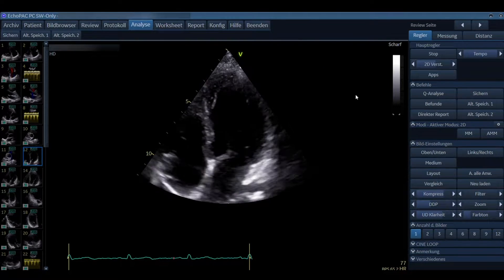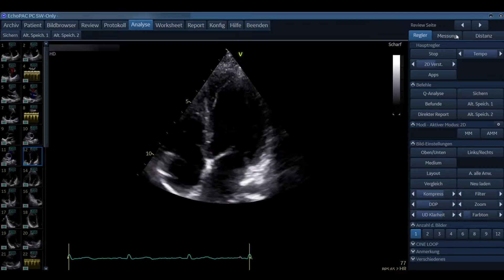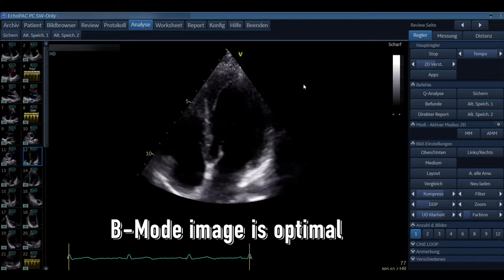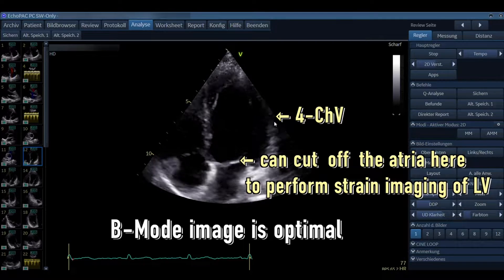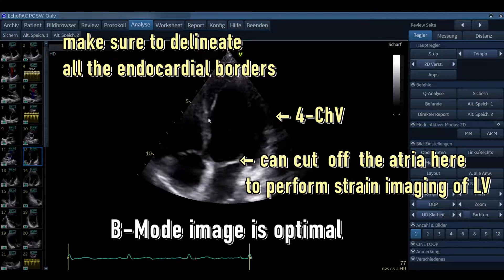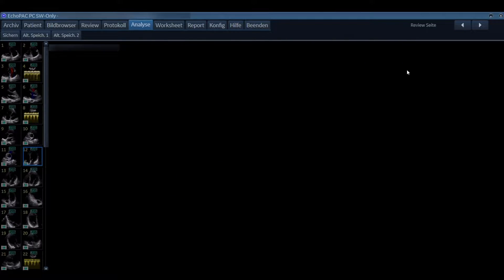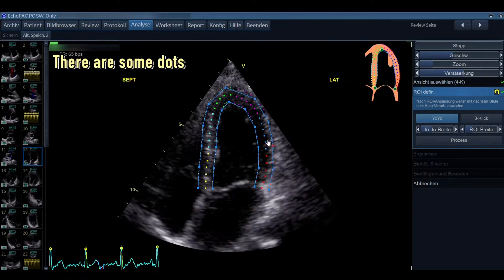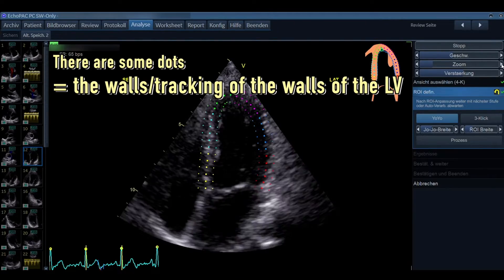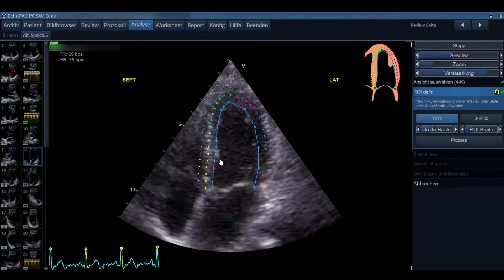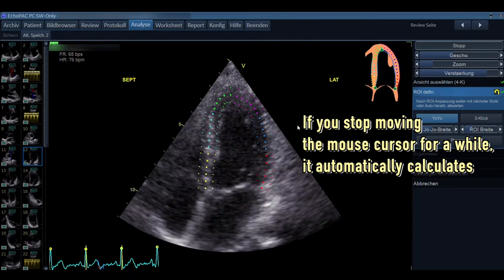In strain imaging, first make sure the B-mode image is optimal. When it's optimal — like in this four chamber view — you could even cut off the atria to focus on the left ventricle. Make sure you can delineate all the endocardial borders. Then go to measure and place the measurement — you will see dots representing the tracking of the walls of the left ventricle. I like to put up the gain so I can delineate the endocardial borders better.